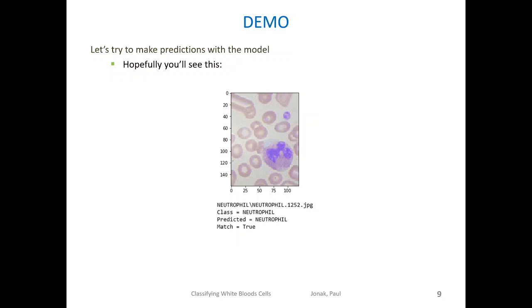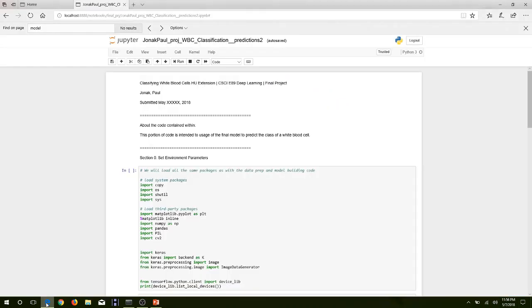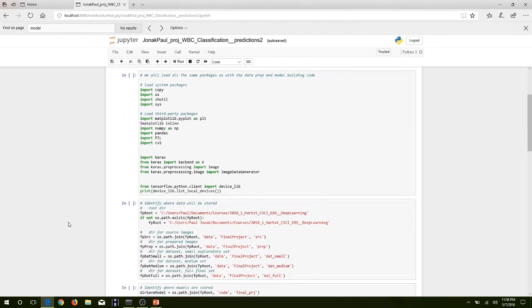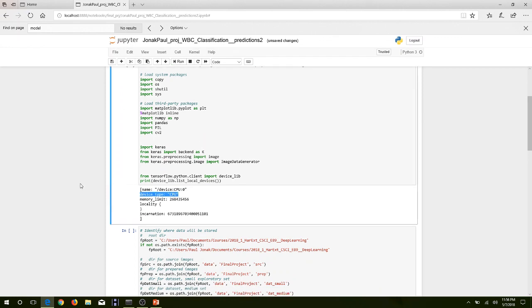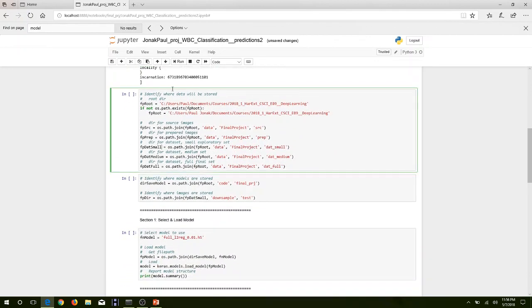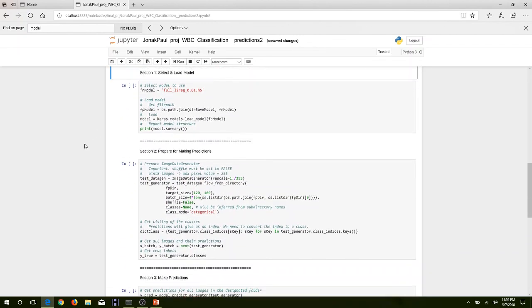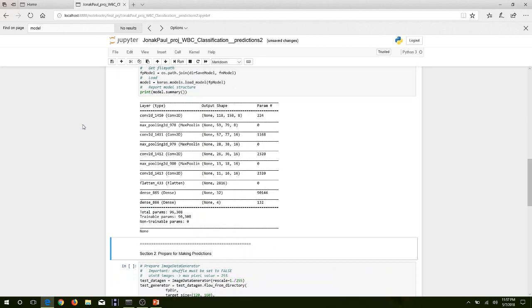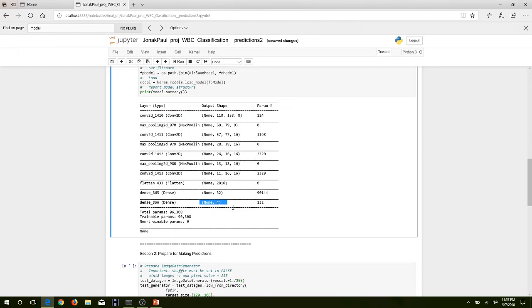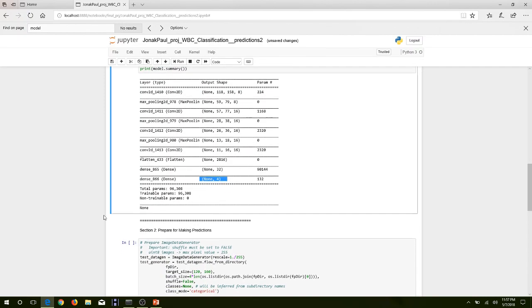Now we're going to take a look at a short demo to see what the output from the model looks like. We have our packages loaded and you can see that we are using the CPU, unlike the GPU which was used during training. Now we are ready to load our model. The summary output shows that we have an intermixing of four convolutional layers and three max pooling layers, followed by a flattening layer and then two dense layers. The last dense layer has an output of four, which relates to the four classes of white blood cells that we're looking at.